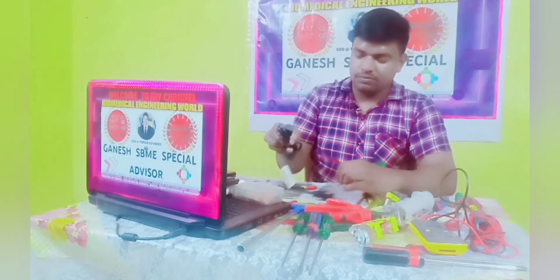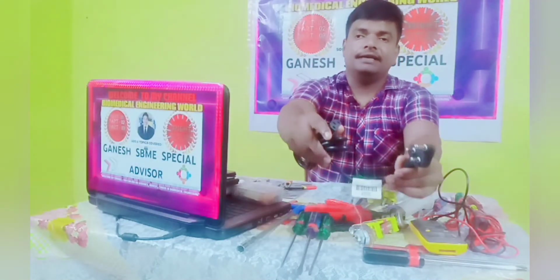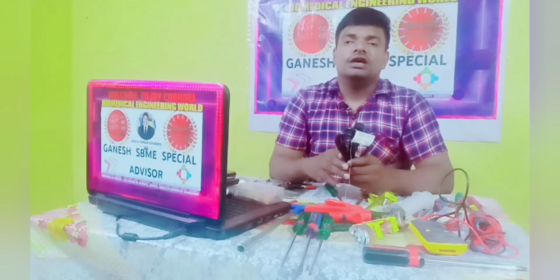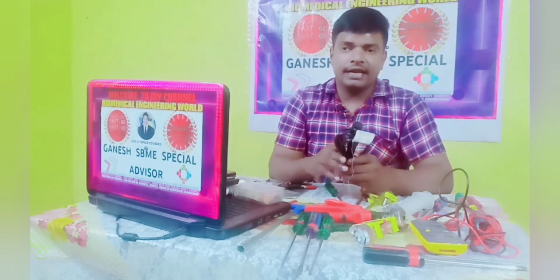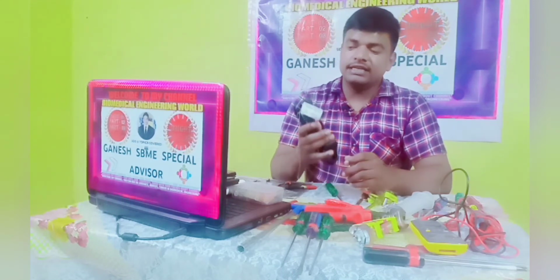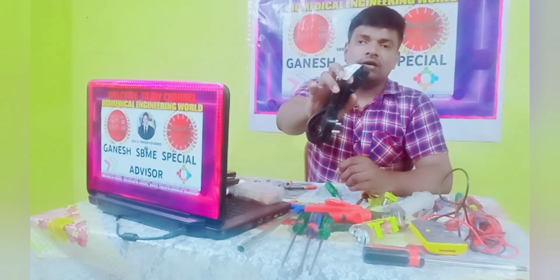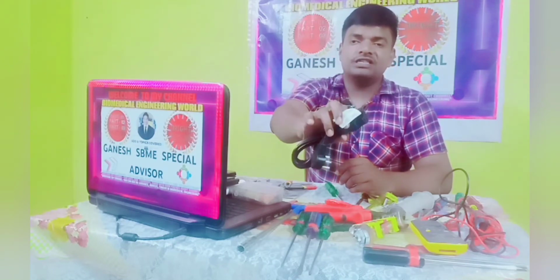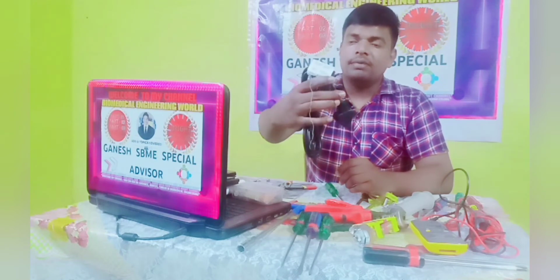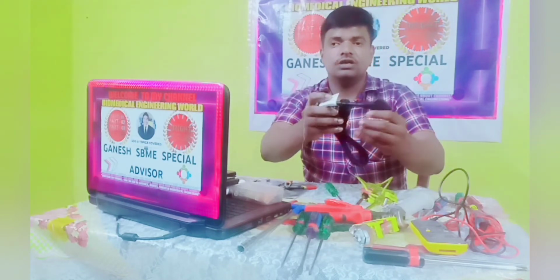Next one, this one, the power cord, a 3-pin power supply cord. As a biomedical engineer you should have this, because if you attend a call to check a machine and power supply is not available, then it is not possible to check. By using this power cord we can check the condition of the patient monitoring system. Not only patient monitors, we can use this power cord for all medical devices to check their power condition. So we have to keep it on standby.